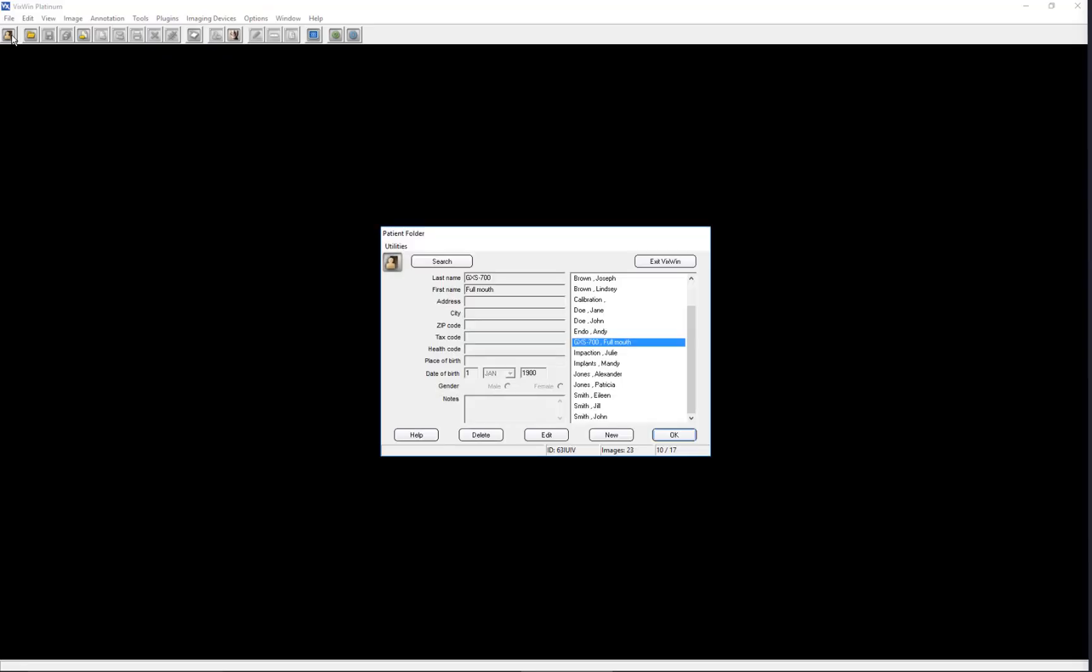Welcome to a Gendex video training series that demonstrates the functionality of VixWin Platinum 3.5 imaging software. Among other things, this tutorial will show you how to access, create, edit, delete, and search patient records.